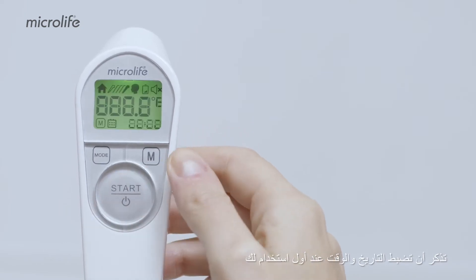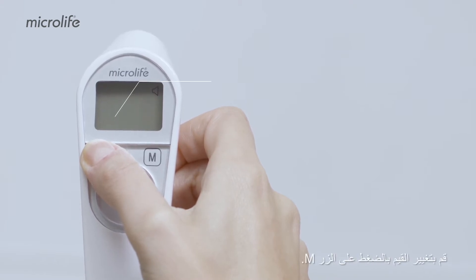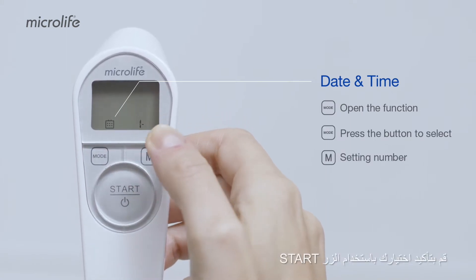Remember to set the date and time on your first use. Press and hold the mode button for the date and time settings, change the values by pressing the M button, and complete the settings by pressing the mode button. Finally, confirm your selection with the start button.